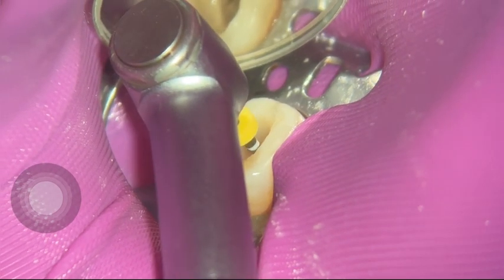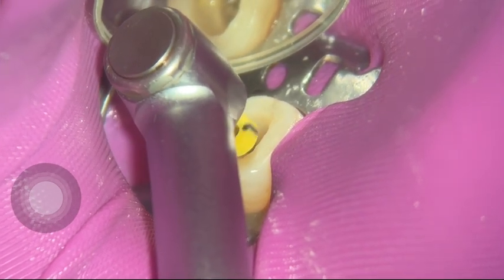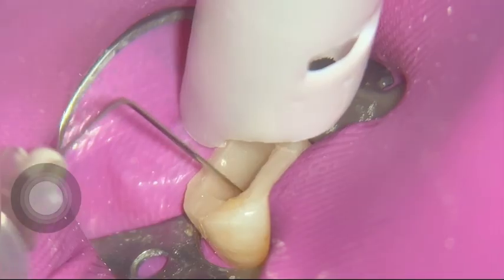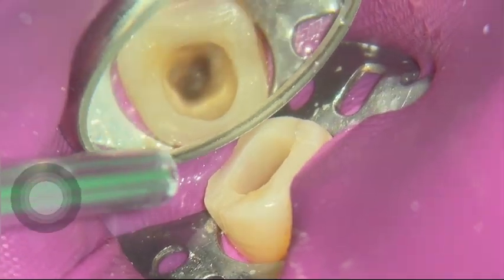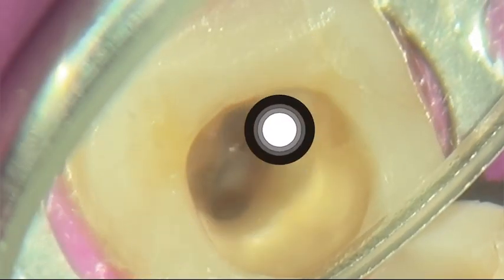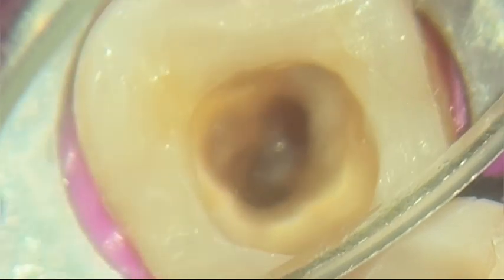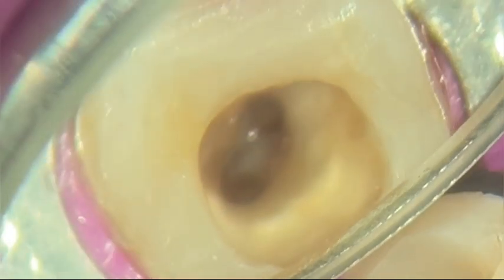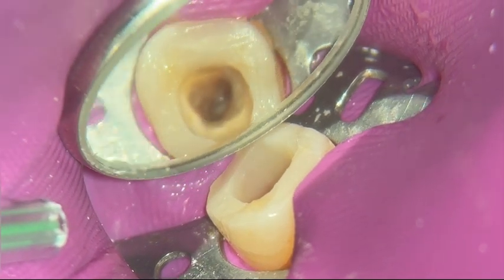Following that, we do our apical gauging, making sure this is the desired sizing instrument. I'm using a lot of hypochlorite — 3% hypochlorite. As you can see here, we have two canals: the mesial and the distal. Pretty nice anatomy, and as you will see later on the x-ray on the cone fit, it is a very, very interesting anatomy.